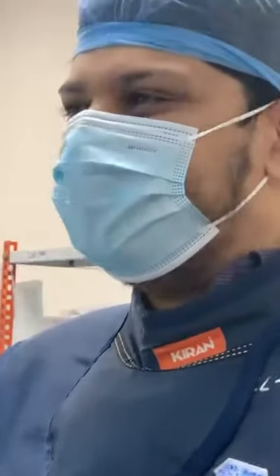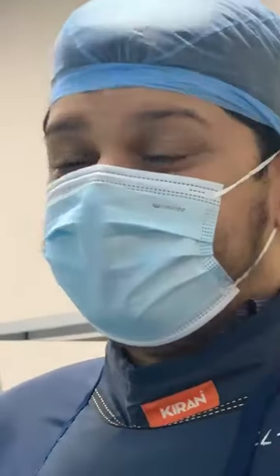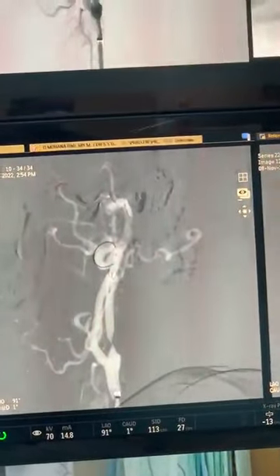In some of the older studies where they compared carotid endarterectomy with carotid artery stenting, in most of the earlier major trials, they did not use any embolic protection device. Now, if you are watching carefully, you can see the embolic protection device is an umbrella-shaped device.